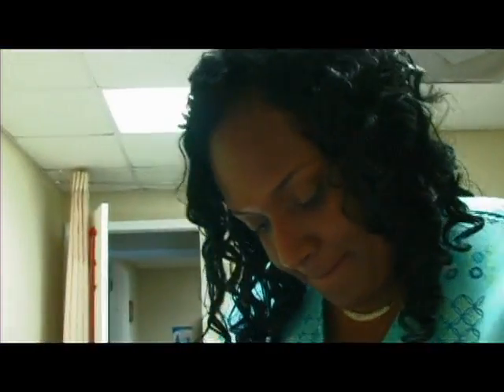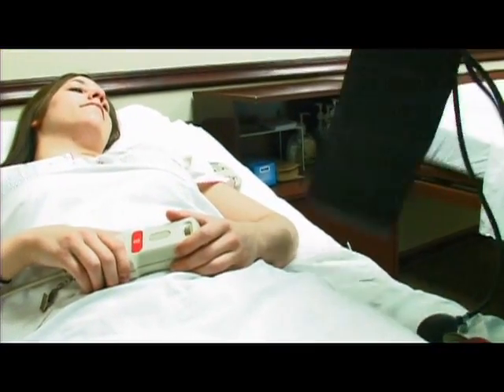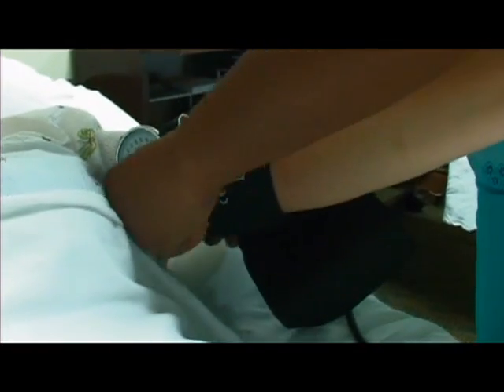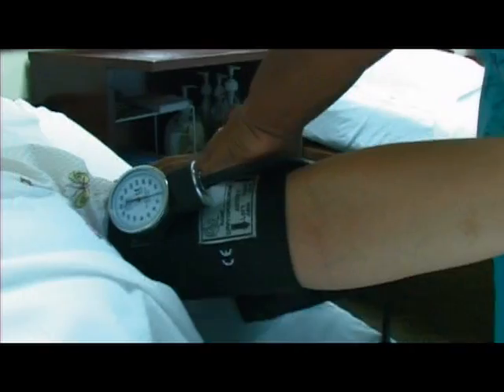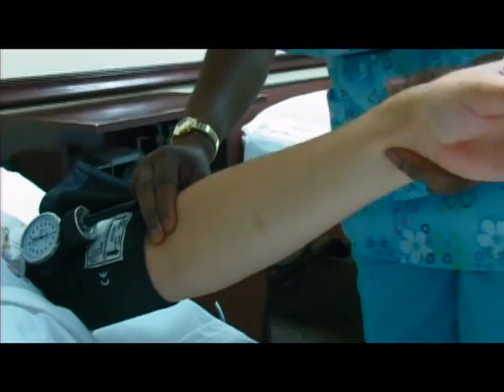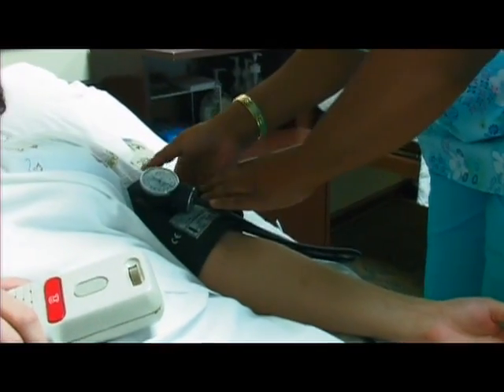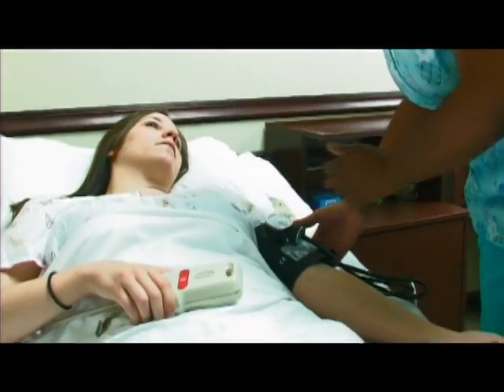Ask the resident: 'Mrs. Jenkins, may I take a blood pressure on your left arm?' Support the resident's arm and make sure that the end of the cuff is two finger widths above the antecubital area, or the inner bend of the arm. You want the cuff at the level of the heart.